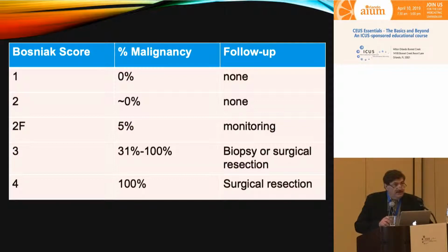So this is an off-label use of the contrast agent. The dose we use is maybe a little bit less than liver, and again, I think our standard dose is about 1/2 of the package dose. As the vendor equipment is getting better, the dose is dropping. We don't have to worry so much. We're not looking for washout, although it does occur in these masses. What's really important is just the enhancement.